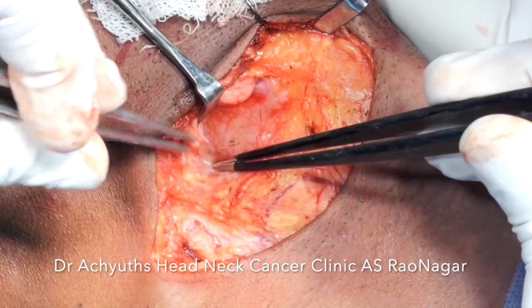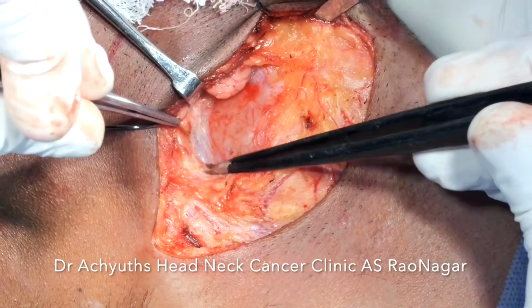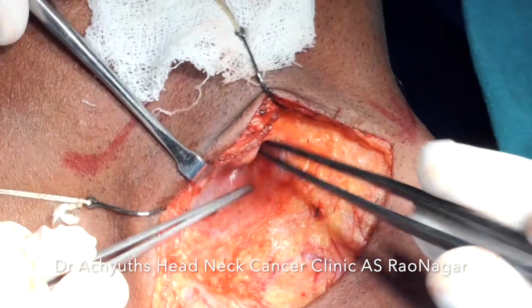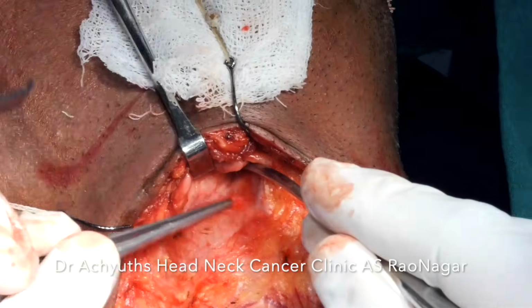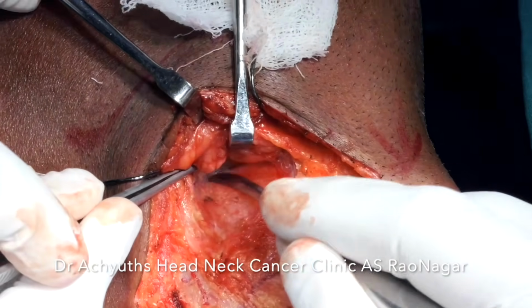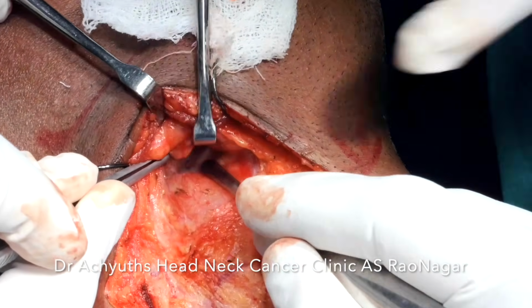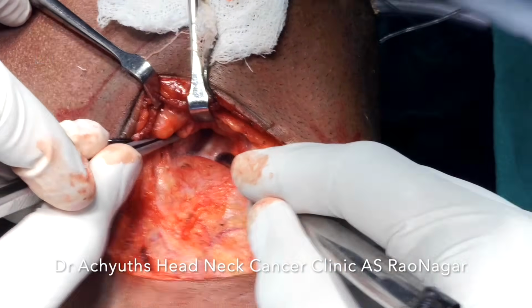This is an almost unedited video which is little longer. So with the help of blunt dissection only, I have taken a tonsil elevator here. You can see that white line, which is the posterior belly digastric, the intermediate tendon, and then the other oblique white line which we are seeing is the hypoglossal nerve.